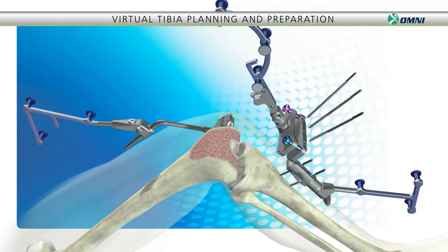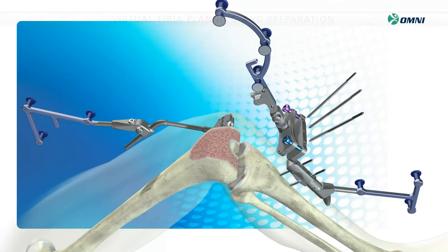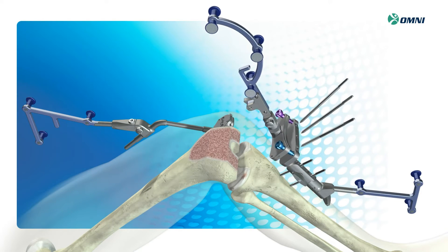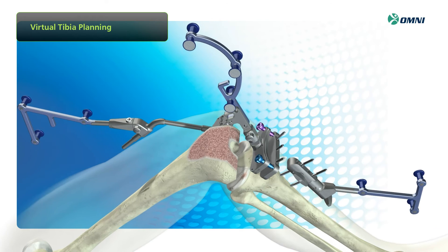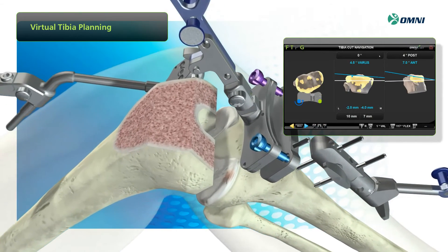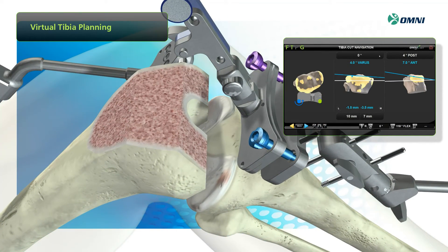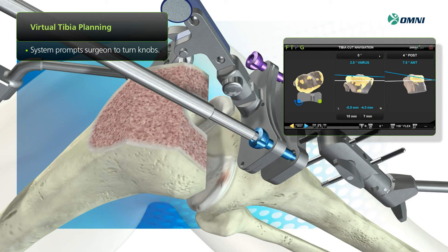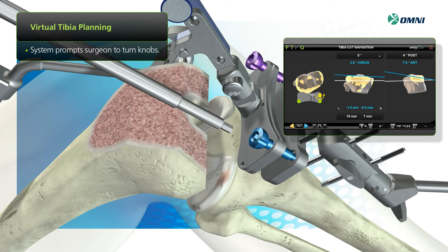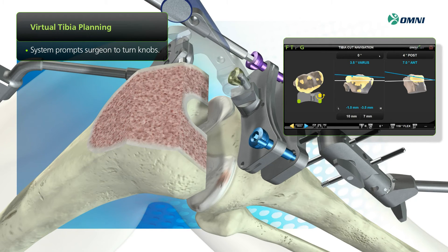Next, we'll show you how easily you can reshape the tibia. First, attach the adjustable cutting guide into position using the three pins as shown. Then position the block by turning the three color-coded knobs. System prompts specify the direction and precise amount of rotation for each knob, and the system displays a green line to indicate the guide is properly aligned.